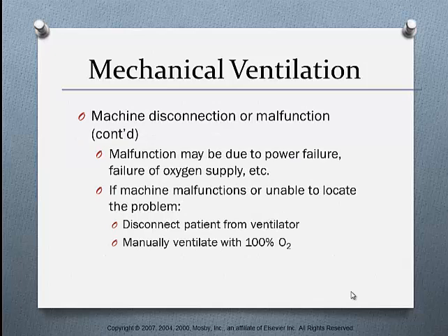We may have a machine malfunction if we have a loss of power or failure of oxygen supply. If we're unable to locate the problem immediately, we may have to disconnect the patient from the ventilator and manually ventilate them with 100% oxygen using an ambu bag.